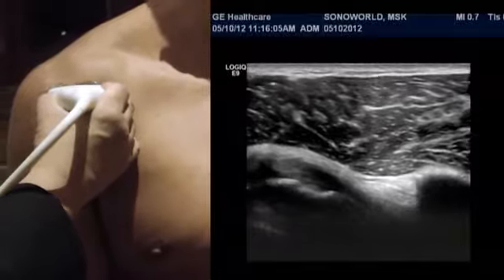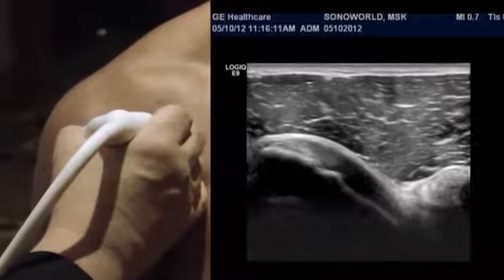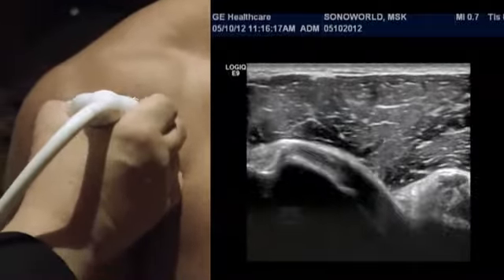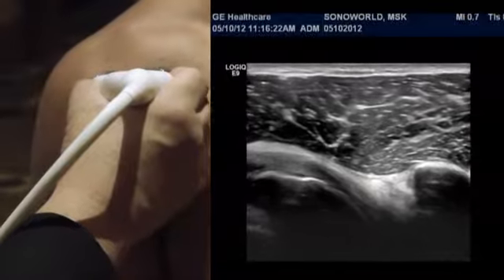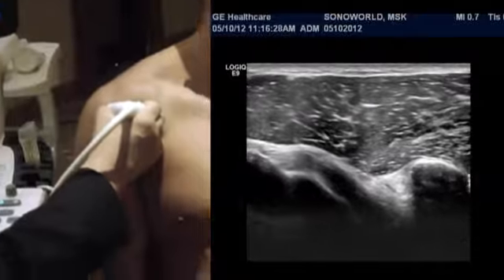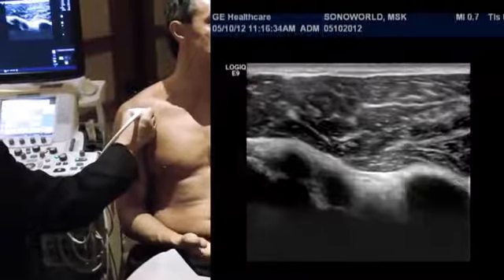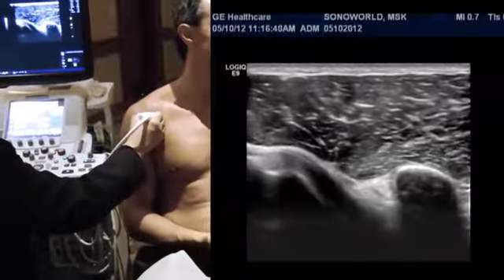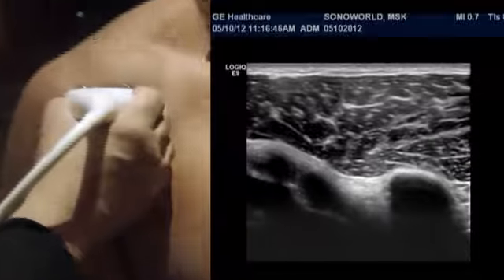Here you see the bone acoustic landmark of the coracoid process, and as he cycles through, notice that now we expose the entire subscapularis. Also, as he internally rotates, note again the distance between the bony coracoid process and the subscapularis. We're going to ask Mike to cycle closer to his abdomen as he internally rotates his arm, and that space that you see is going to be the coracohumeral space. So the second dynamic imaging that you're seeing in the anterior region of the shoulder is going to be where you could have a coracohumeral impingement.